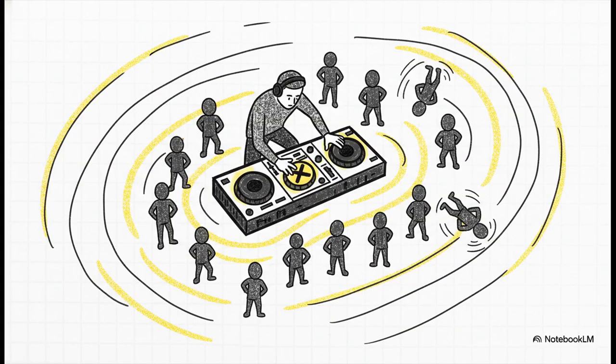So imagine this. The DJ leans over the console and just hits this massive bass drop. Boom! In the MRI world, that's what we call a 90-degree RF pulse. It's this powerful burst of radio energy that basically knocks all our dancers, our little protons, sideways. It tips them over 90 degrees and gets them all spinning, dancing, in perfect sync.